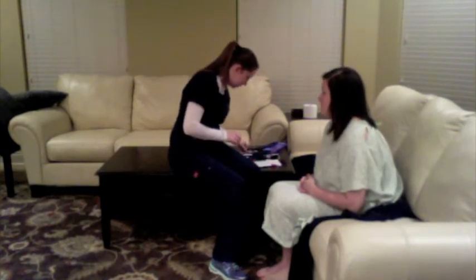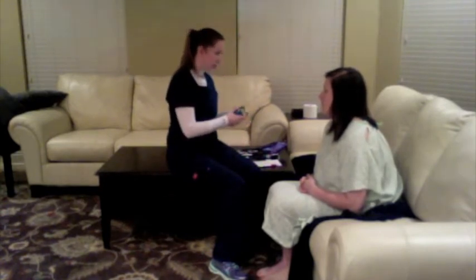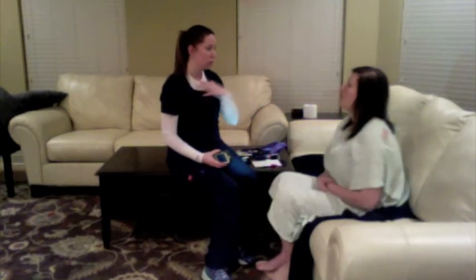Okay, let's see. Now I'm gonna look at your pupils. So I'm gonna shine this light. Just keep both eyes open and look straight ahead.